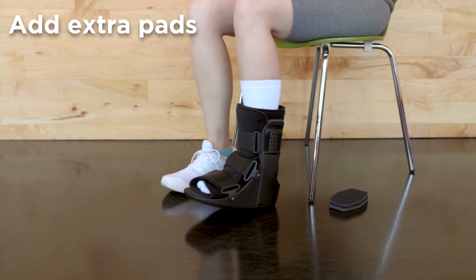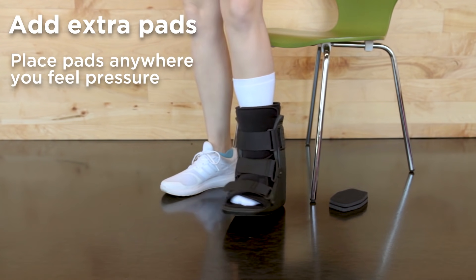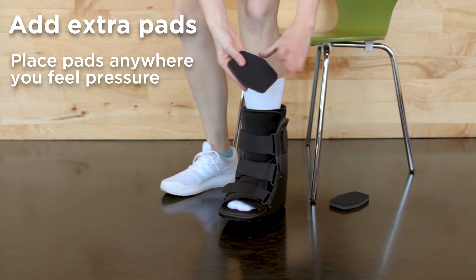Finally, once you have the boot on, move around a little. If you feel any weird pressure points, you can use the foam pads to alleviate the pressure.